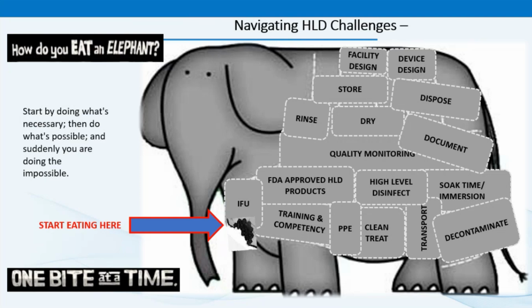So be sure and note the expiration, storage, or shelf life date. The Joint Commission has cited facilities for using expired high-level disinfectants. Pay attention to the reuse life. That's the time period the disinfectant solution can be used. And follow the manufacturer's time and temperature requirements, monitoring and documenting both.